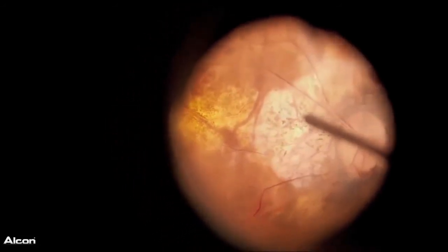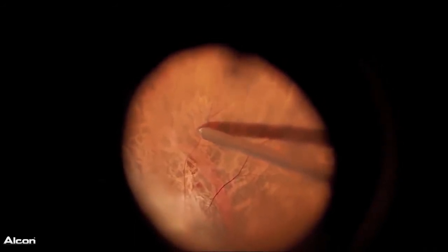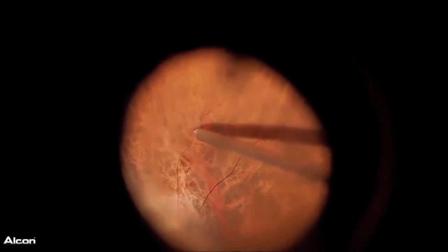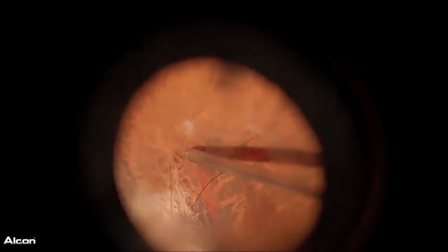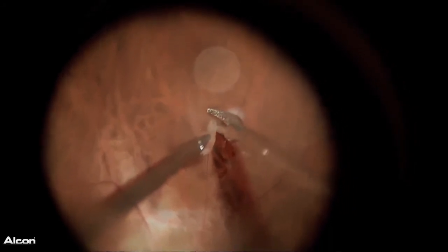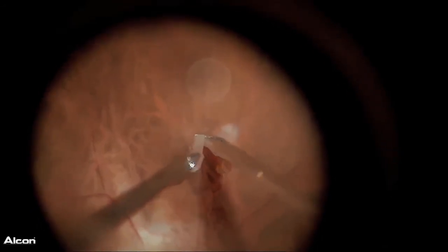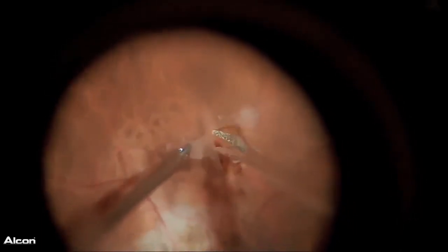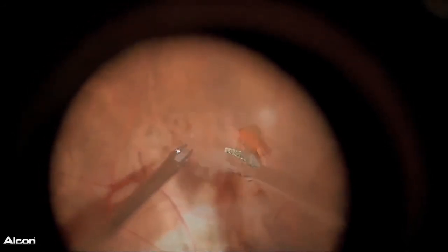You can check the size of the large macular hole, and then I checked which size should be harvested from the nasal inferior side of the retina, and then I marked it with diathermy. So at the edge of the retina, I tried to make a small piece of retina using vertical scissors. But this surgical technique is a little bit challenging because this eye is very long, and the actual axial length is probably 30 millimeters.